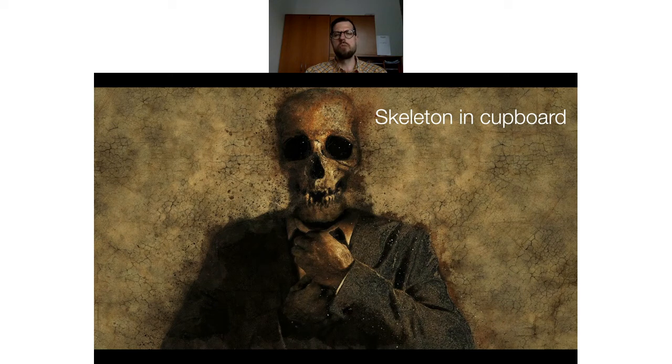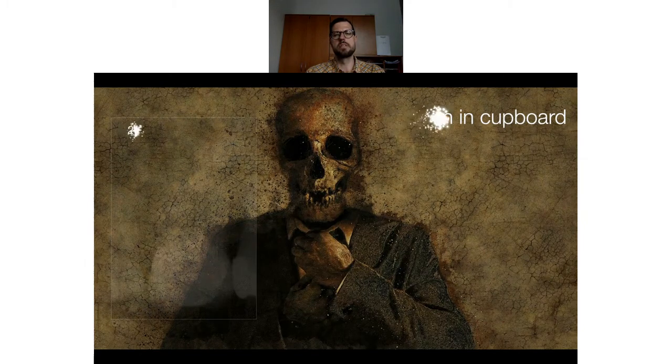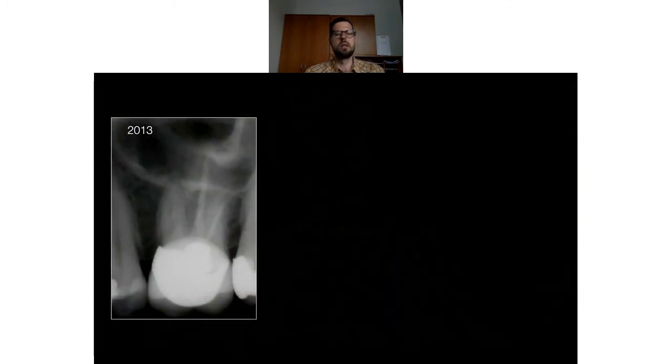So every one of you maybe has a skeleton in the cupboard. What does it mean? That in the past you did something and you were not 100% sure, and now after some years it will come back, and you have the funny feeling, okay, that something went wrong in the past. So let's look at this case. So we see this maxillary first molar, and it came to me in 2013, and we see that only the palatal and then the distal buccal is filled, and the mesial buccal root is empty.